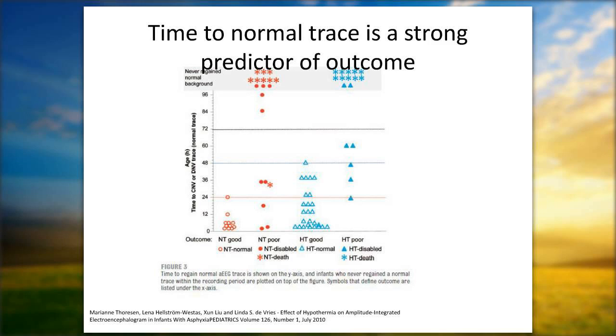Any other questions about aEEG and cooling today? Again, I just encourage everyone who's listening, who didn't come on live, to really participate in the forum and to get more engaged there and just really chat to each other. Gabriel's little final point here is, I think every baby with high risk for brain injury should be monitored as we measure oximetry for the body and other organs. I couldn't agree more.